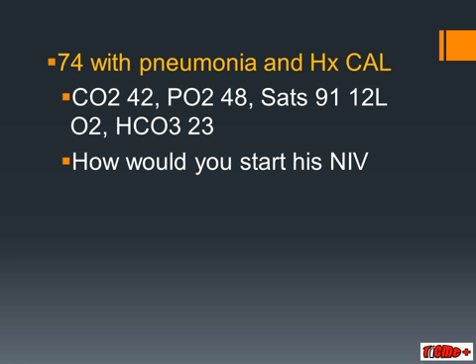So you have two choices, whether you start this patient on CPAP to fix the hypoxia, or whether you start the patient on bi-level, but with an emphasis on the EPAP value. I think in this setting, I would start the patient on bi-level, but I would remember that my goal is to fix the hypoxia, and I would be augmenting the PEEP to try and achieve better SATs.